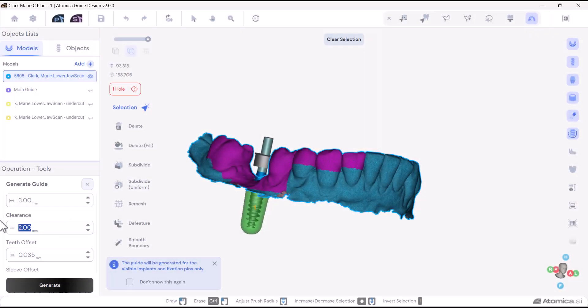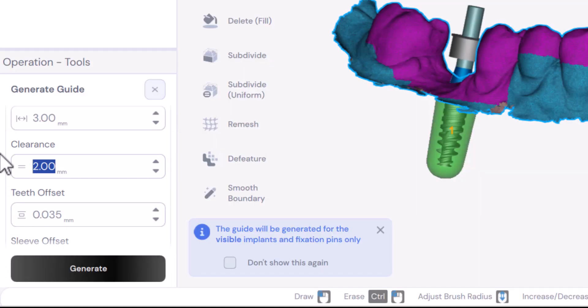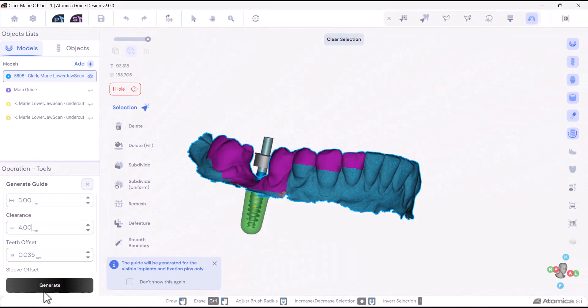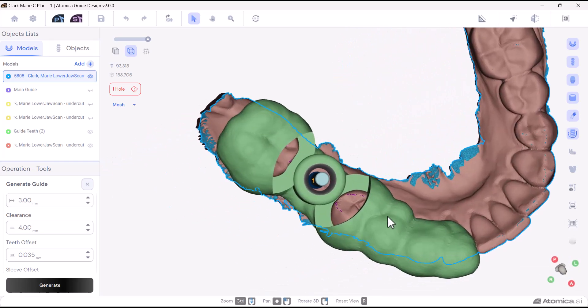The second parameter is the clearance, which is defined as a subtracted imaginary cylinder around the added material surrounding the sleeve. This parameter provides additional space for the drill's pathway and can also serve as inspection windows, allowing you to ensure the guide is properly seated.